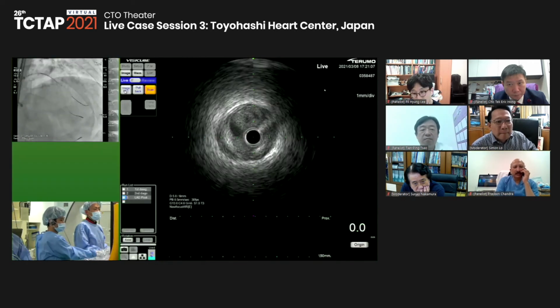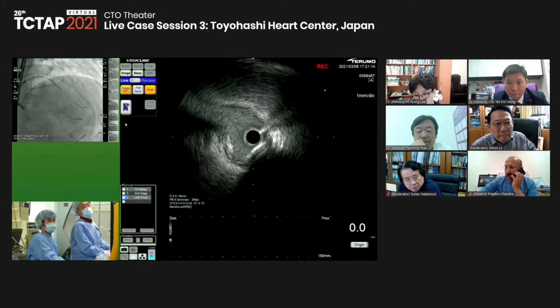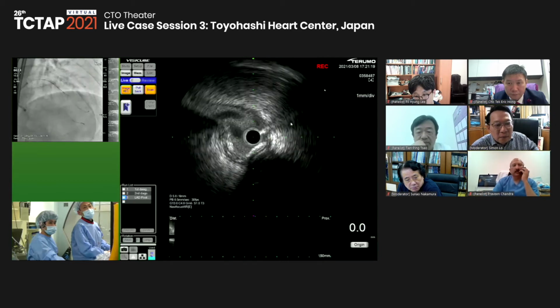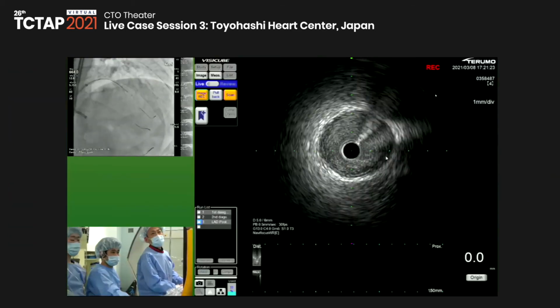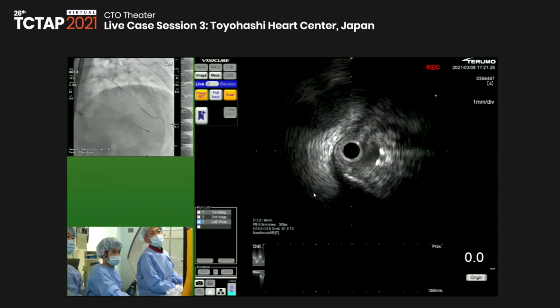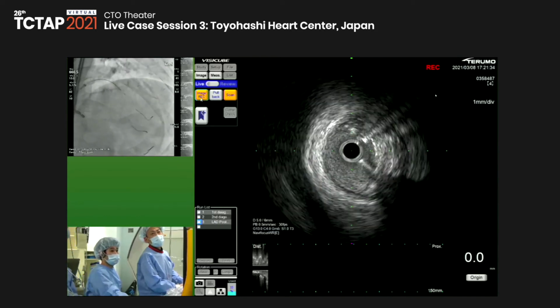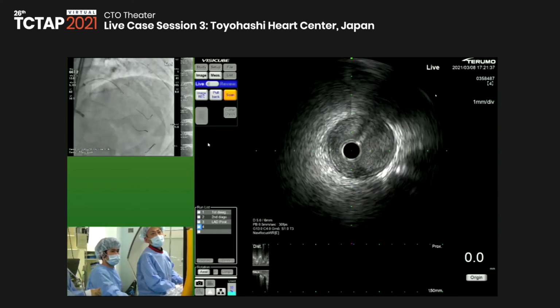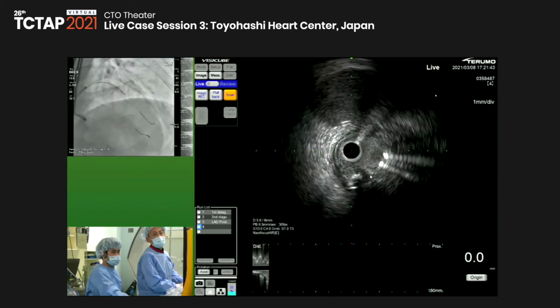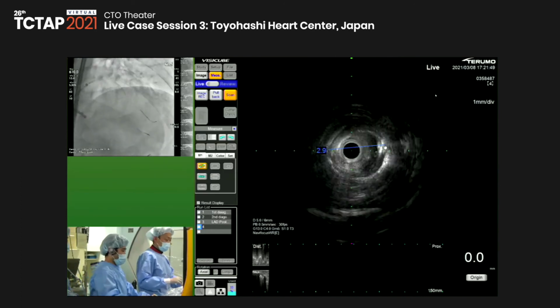Okay, so IVUS is here in the first diagonal. So the first diagonal is also very big. Maybe size is 2.5 something. And then LAD is coming from the 3 o'clock. So the orifice has some disease. But fortunately, the plaque distribution is the septal side, right? But anyway, I'm afraid of side branch compromise for stenting.